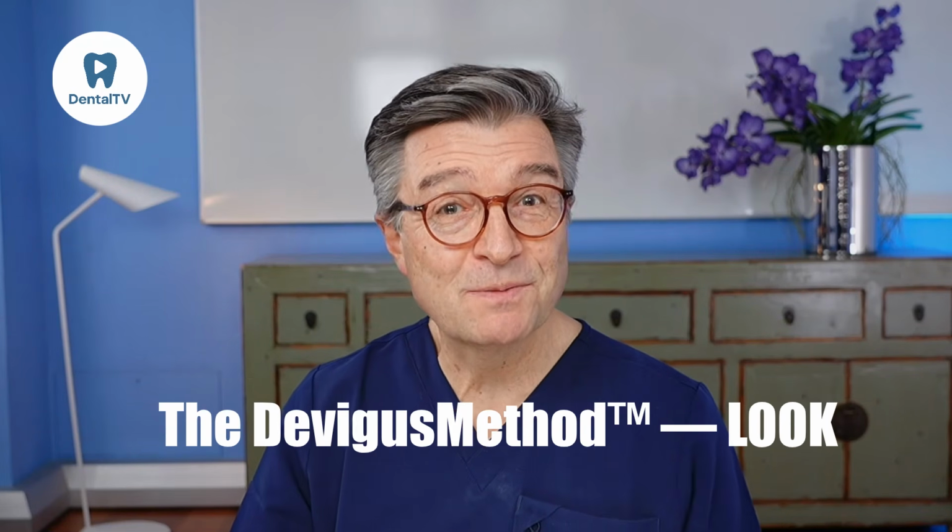Welcome to the look phase of the Devigus method.